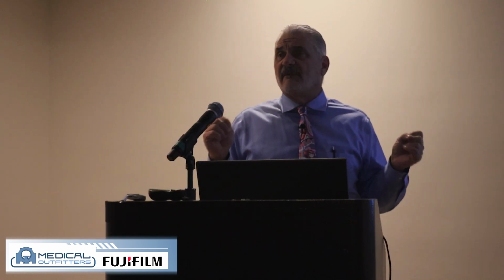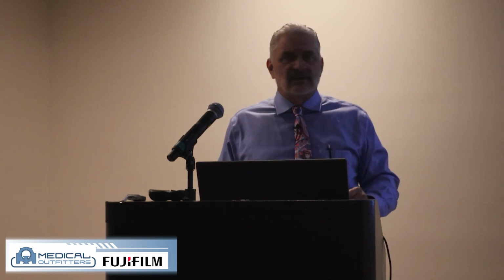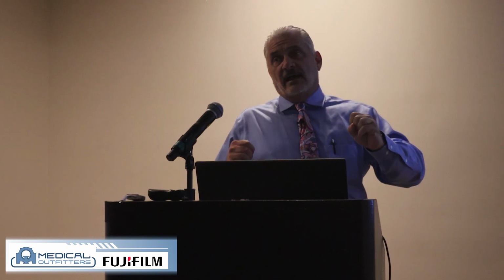Now, those of you that do cardiac imaging, do any of you do functional cardiac imaging as well? Do you know the difference between prospective and retrospective gating? So prospective is if you've got that ideal heart rate, right in the money of maybe 60 to 70 beats per minute, under medication. I would do it prospectively, a little less radiation, and it will give you a beautiful study if the heart rate is right.